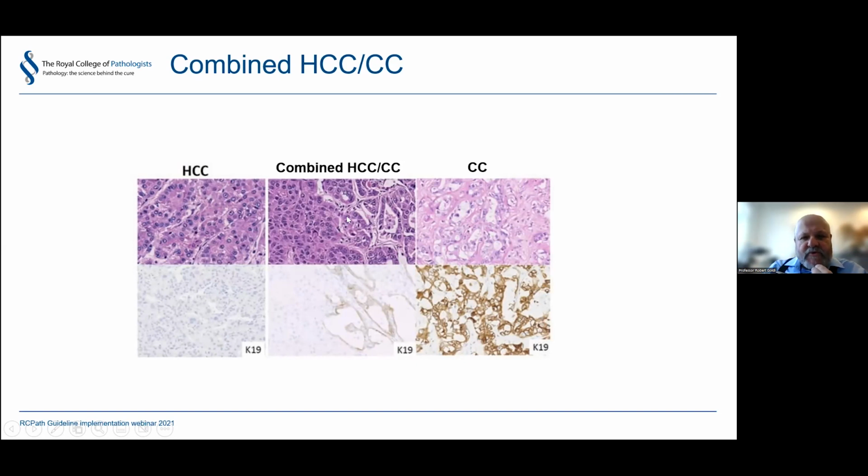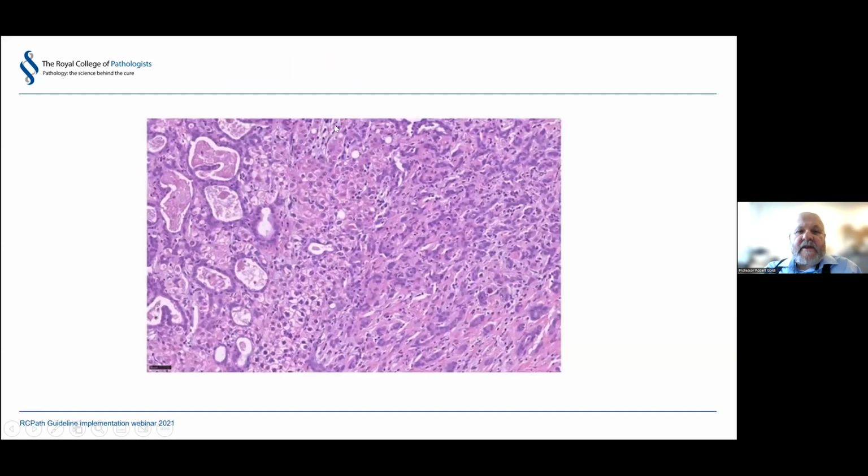But there are clearly tumors which share features of both. And here's a very clear-cut example. No one looking at the bit here would think that was an HCC. No one looking at the bit on the other side would think this wasn't cholangiocarcinoma. And yet it's clearly part of a single tumor, and that's reflected in the immunohistochemistry. Here is a tumor in fact showing all kinds of cancer together. Here is the large duct, columnar cells with mucin. Here's the small duct, anastomosing cords, and with HCC in the middle. They can all go together.